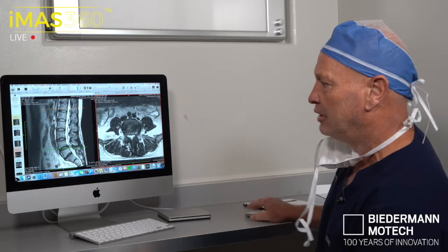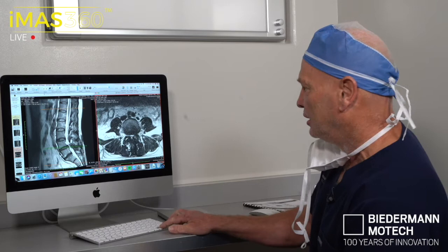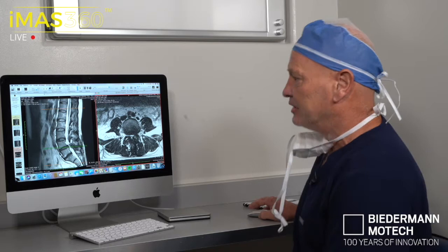Athletic position, neutral, flexed forward was comfortable. Bottom line, she's got a grade 1 spondylolisthesis at L4-5. You can see the obvious central stenosis through the 4-5 segment. Circumferential, when we go over to axial view, there's definitely a much bigger left-sided facet with hypertrophy, a lot of ligament hypertrophy, and scar at the decompression zone. She's got advanced degenerative changes within the facet complex, severe central stenosis, and bilateral lateral stenosis.